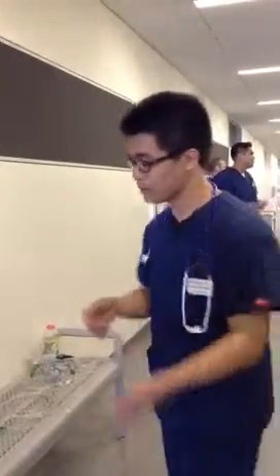Okay, so you go to the patient's room, knock on the door. Hi, Mr. Cartman. My name is Anthony. I'm from the respiratory care department. I'm here to give you some oxygen. Give me a moment to wash my hands and we'll get started. So I'll go and wash my hands, 15 seconds.